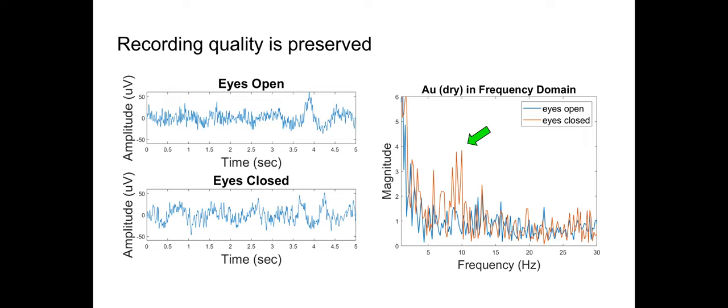Yeah, it seems to be fine, because in both the unloaded and loaded conditions, we observed pretty negligible shifts in the resonance frequency when there was an electrode with a wire too. It was kind of hard to see in the pictures, but there was an electrode connected to a wire. We just used one, but I don't think that if there were more, it would make a big difference.